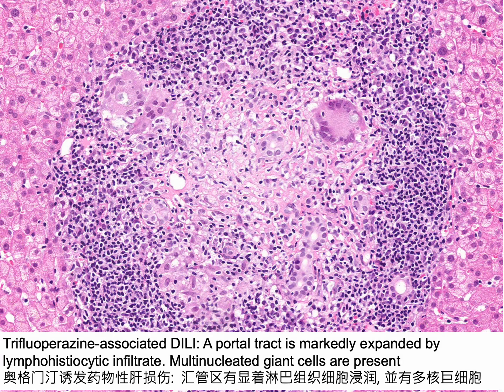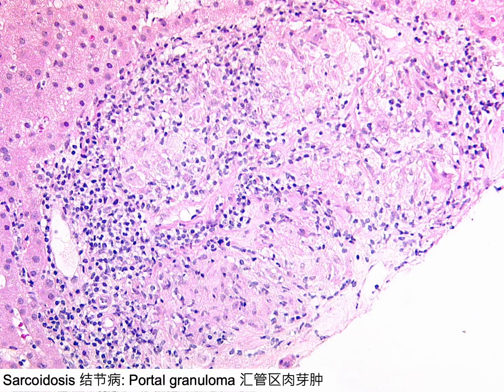This is an example of trifluoperazine-induced liver injury. The portal tract is significantly expanded by a lymphohistiocytic and granulomatous infiltrate featuring multinucleated giant cells. This liver biopsy is from a patient with hepatic sarcoidosis, showing multiple non-caseating epithelioid granulomas within a portal tract.